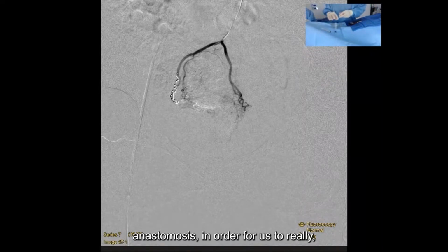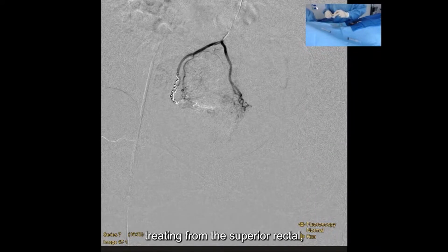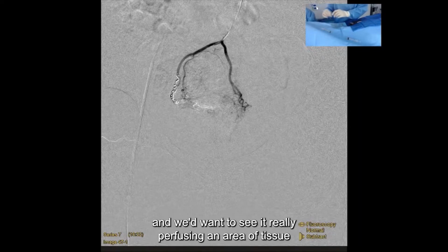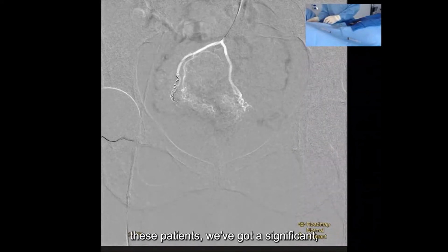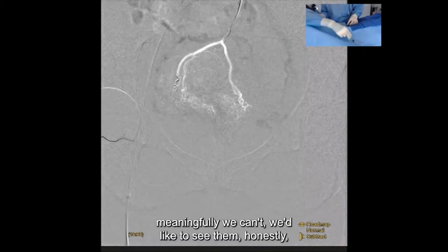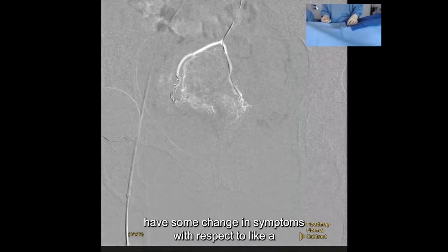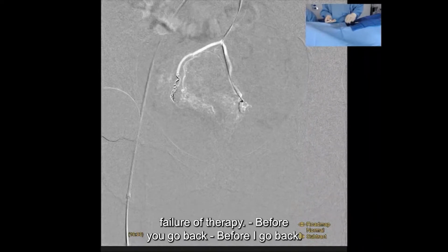In order for us to really go treat a middle rectal in the same session of treating from the superior rectal, we'd have to see it as a really prominent inflow vessel. And we'd want to see it really perfuse an area of tissue of the hemorrhoidal cushion that we couldn't get to from here with our beads, because these patients will get a significant, back again. So meaningfully, we'd like to see them have some change in symptom with respect to a failure of therapy. Before we go back. Yeah.